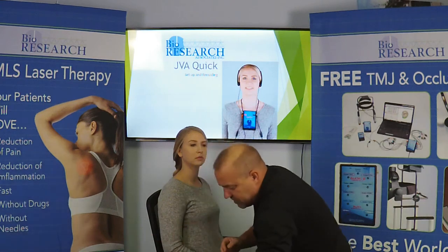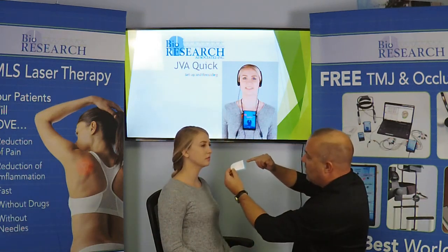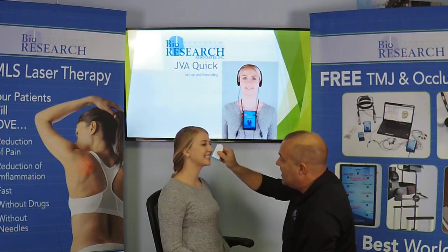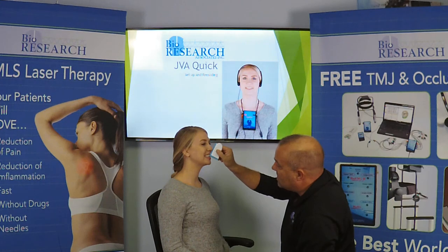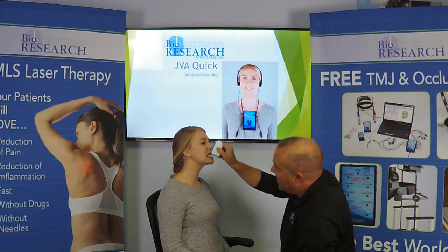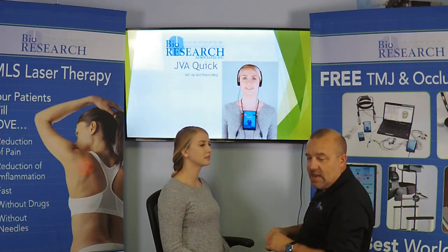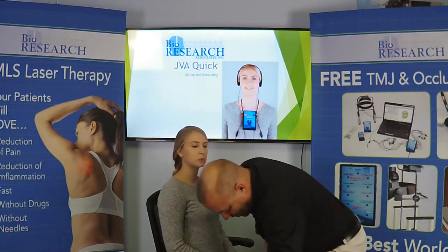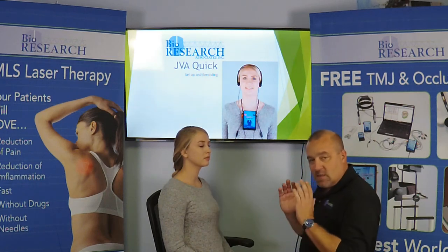Now for protrusion, you'll see the gradations we have here on the right side of the range of motion card. Bite, let me see your teeth. We just stick that right on the teeth. Now stick your jaw out like a bulldog as far as you can, and she goes to 10. So we can enter 10 millimeters.